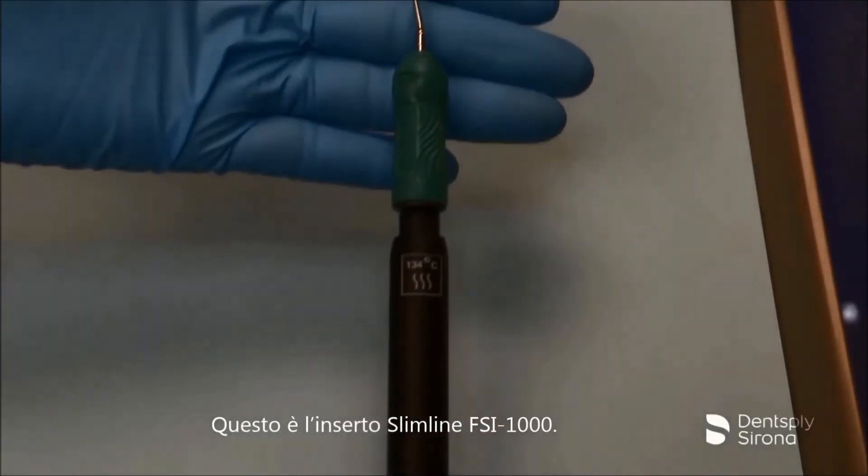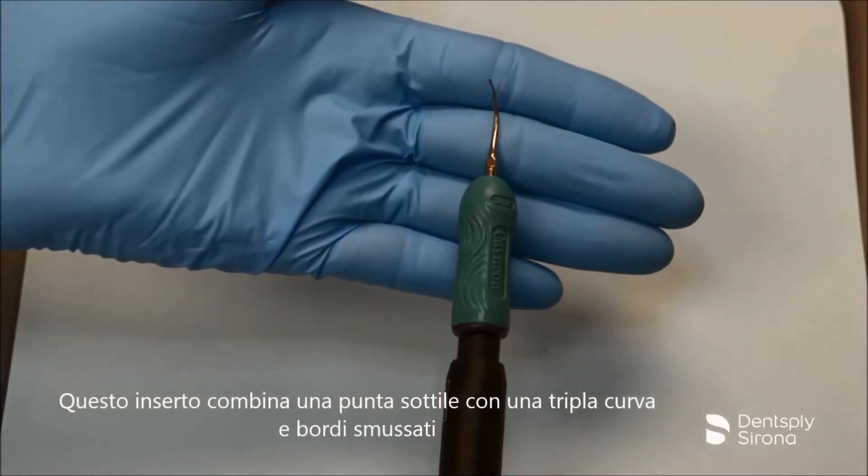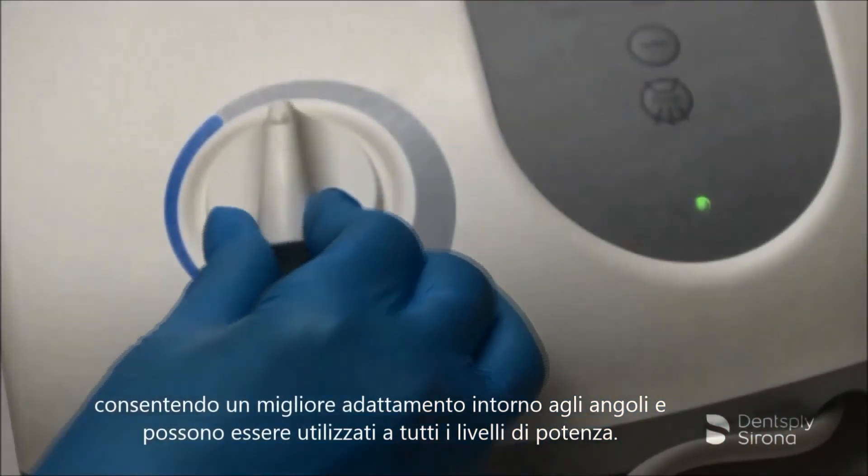This is the Cavitron FSI Slimline 1000. This insert combines a slim tip with a triple bend design with beveled edges, allowing for better adaptation around line angles and can be used at all power levels.